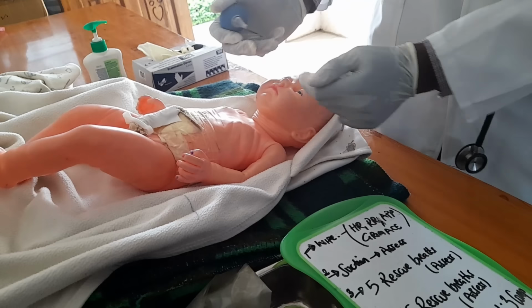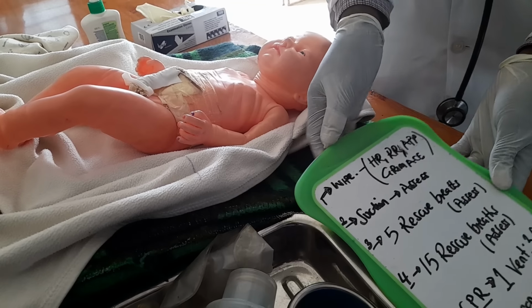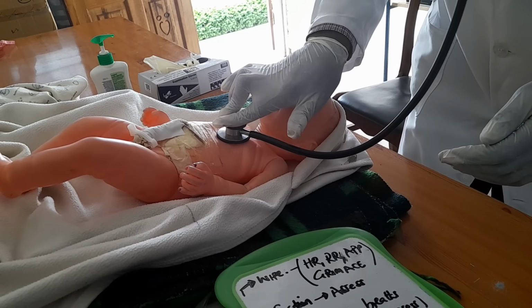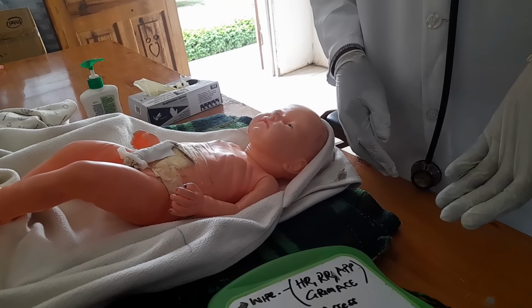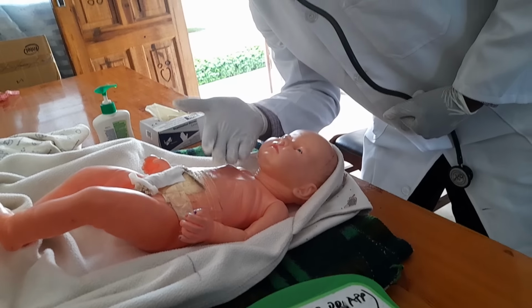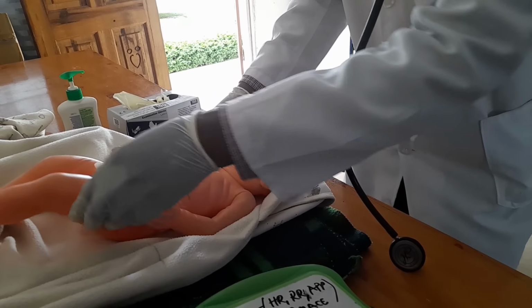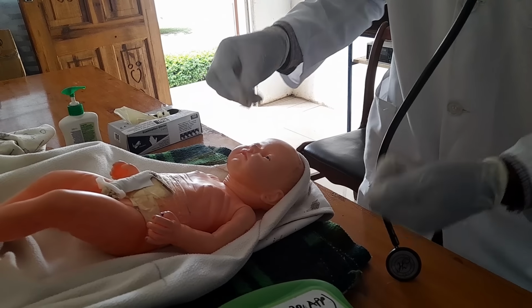Once you suction both the mouth and the nostrils, then you have to assess. So an assessment will still remain the same. You start with the heart rate. You put your stethoscope on and go there. You can tell the examiner that the heart rate is still below 100, and then respiratory rate, you check for the rise and fall of the chest. You still say that it is absent. Then appearance, the baby still appears blue. Then for grimace, you check the muscle tone. You try to stimulate the baby. For grimace, meaning that you are looking at activity, even as you were suctioning, the baby wasn't moving.